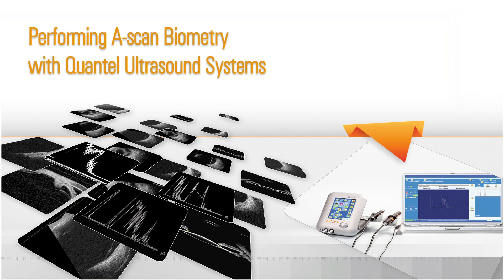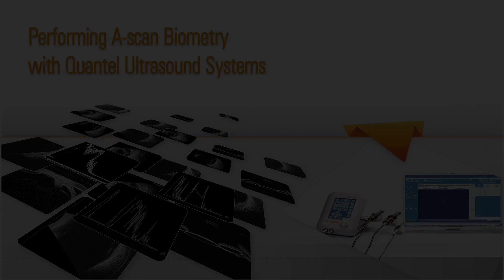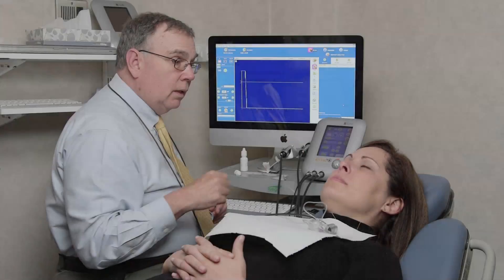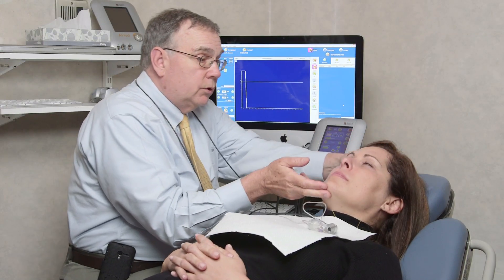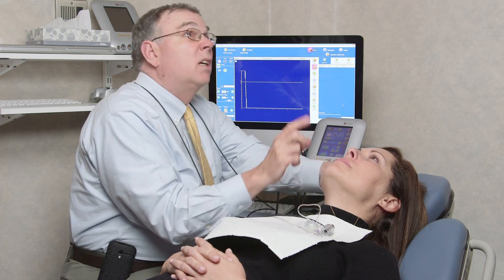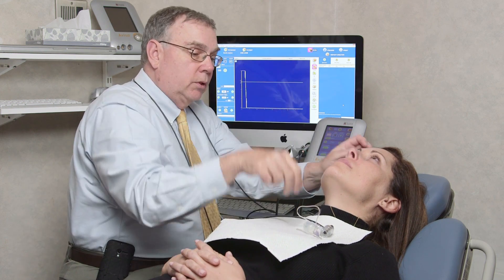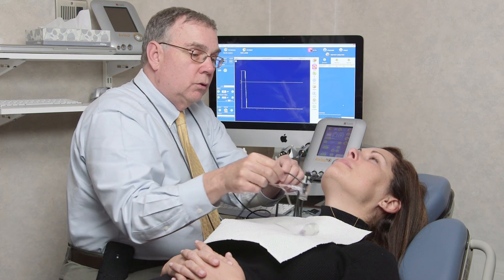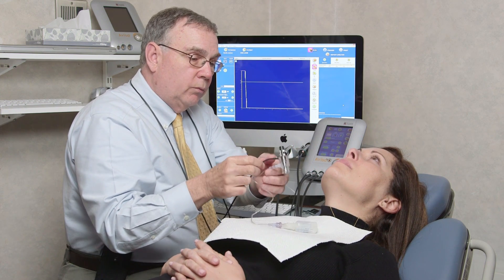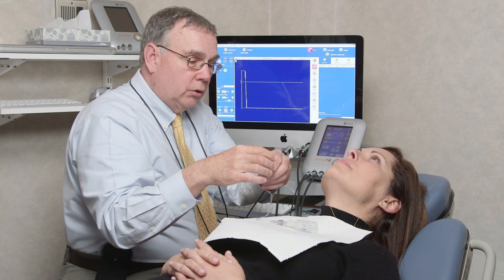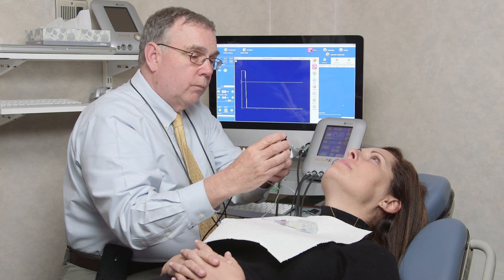Performing A-scan biometry with Quantel Ultrasound Systems. In this brief video, we'll review the fundamentals of performing A-scan biometry with ultrasound equipment from Quantel Medical.